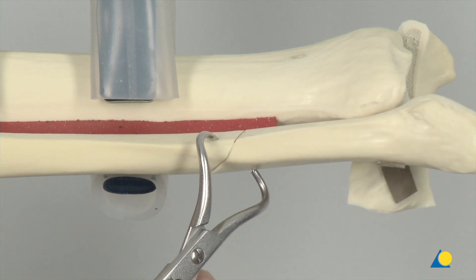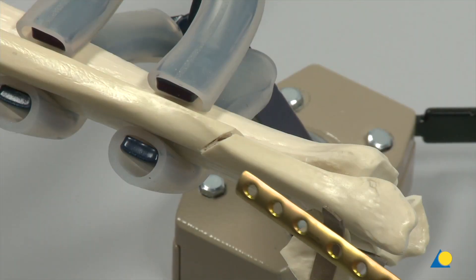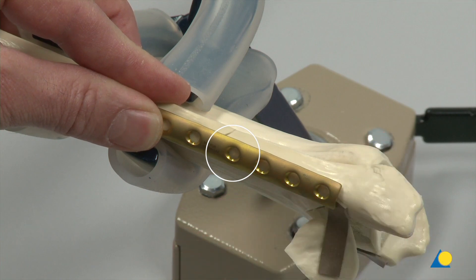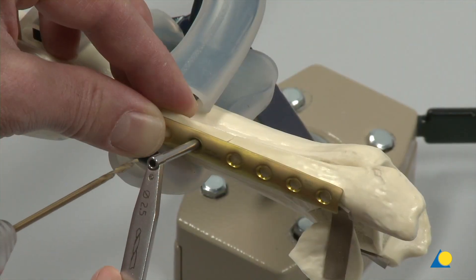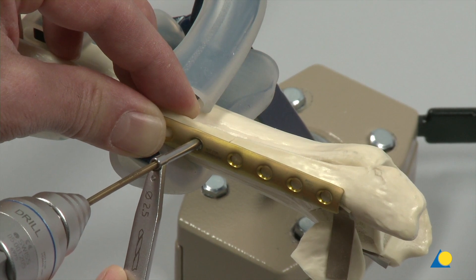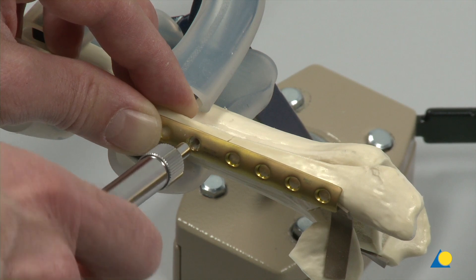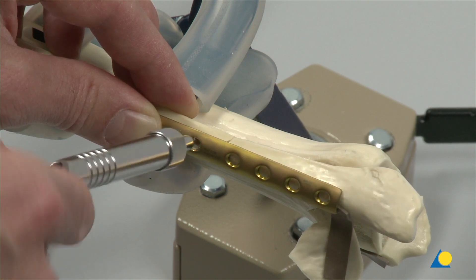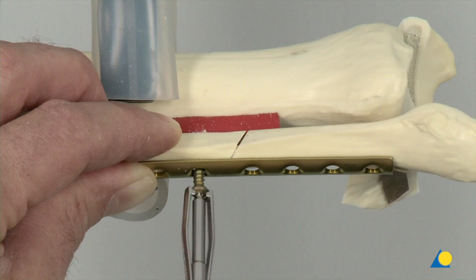The pointed reduction forceps are used to reduce the initial fracture displacement. The 7-hole LCP 1/3rd tubular plate is placed onto the bone with the middle hole distal to the fracture; this hole will be used for the lag screw. Contouring is not necessary. A neutral hole is drilled through the 3rd proximal plate hole close to the fracture using the 2.5 mm drill bit and 2.5/3.5 universal drill guide. The required length of the screw is measured with the depth gauge. The 3.5 mm self-tapping cortex screw is selected and inserted using the hexagonal screwdriver.